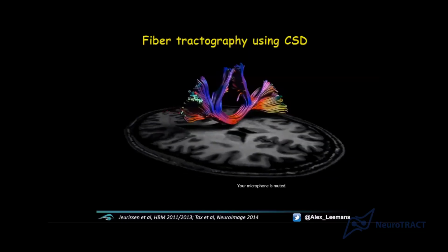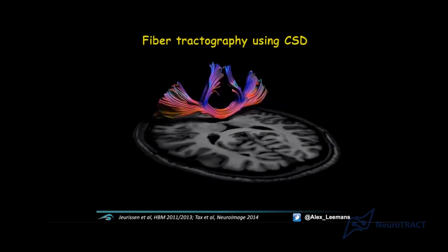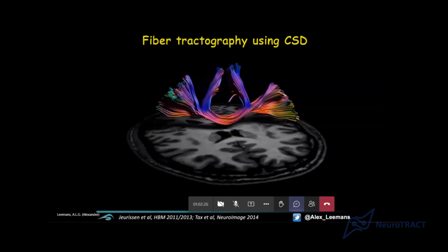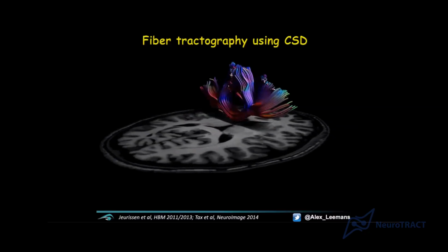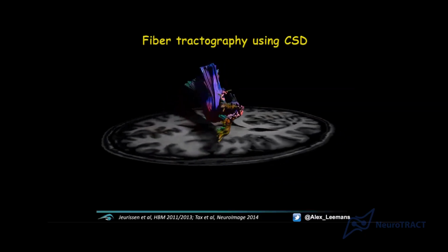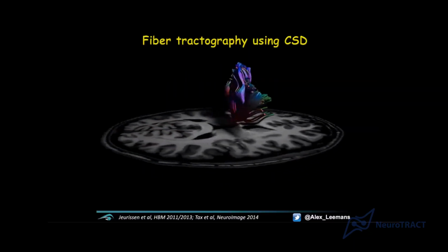Obviously, you can play devil's advocate, and you can think of a voxel where there's one population making a bend. Well, from a diffusion point of view, you cannot really disambiguate a bend in a voxel from a crossing in a voxel. The diffusion profile will end up with the same result. So this is something that is ongoing in terms of trying to fix this. This is an important topic of research.